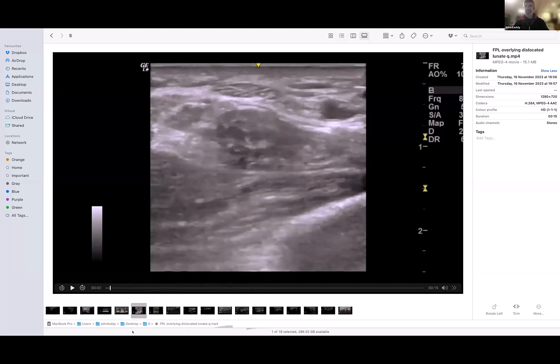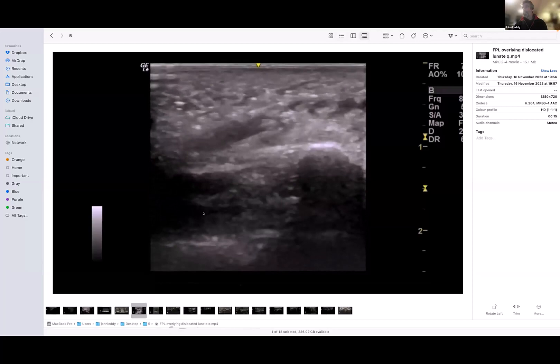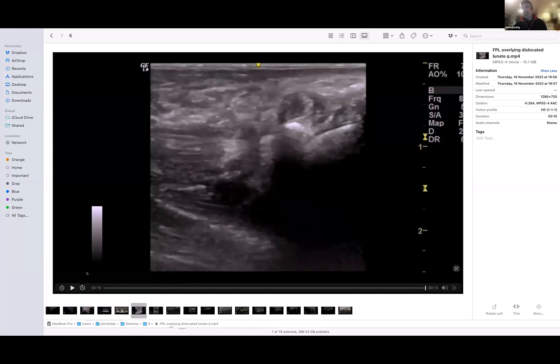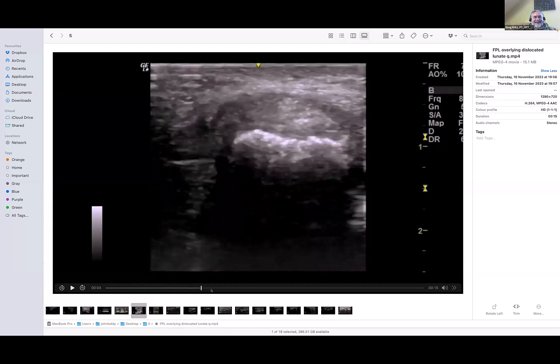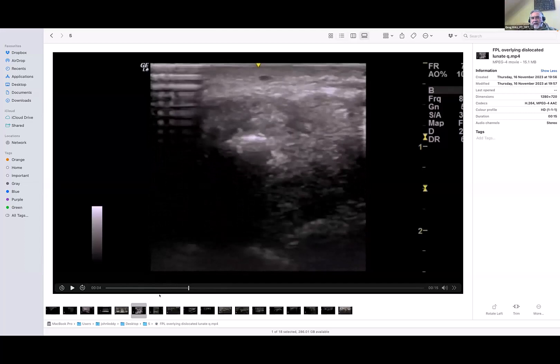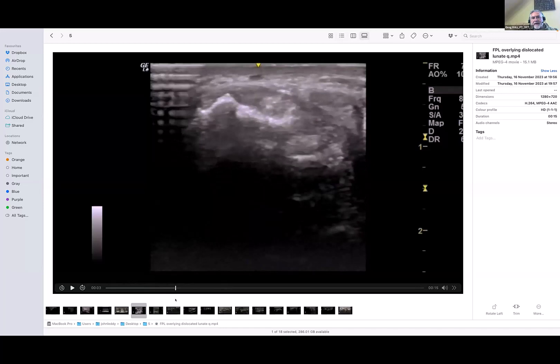Next time you scan a wrist, just remember that one. The pollicis longus is sending through there — why is it resting against a bone right under the skin? That's probably FCR — flexor carpi radialis — somewhere around there. It was just so right out of the blue: you're thinking, I'm just looking at an odd, worn-out wrist with a mildly injured tendon — and then, oh no. That's proximal to the carpal tunnel. That's probably the transverse carpal ligament there. There was some pain.